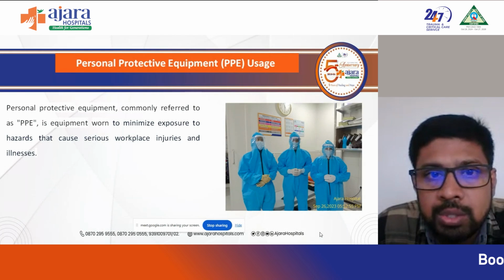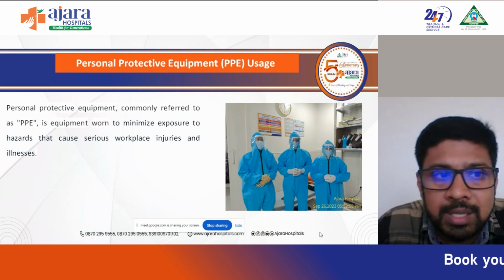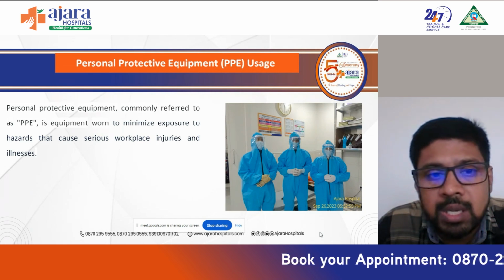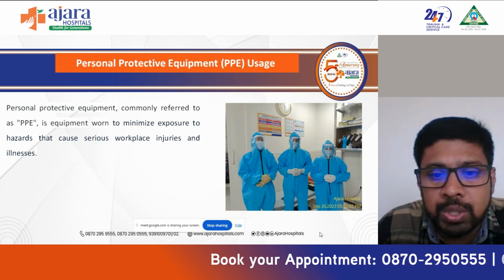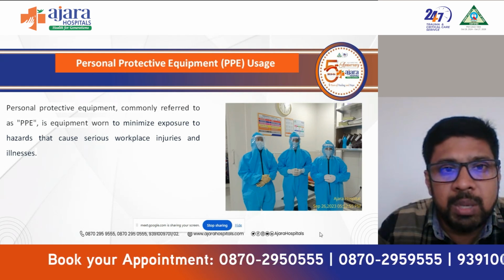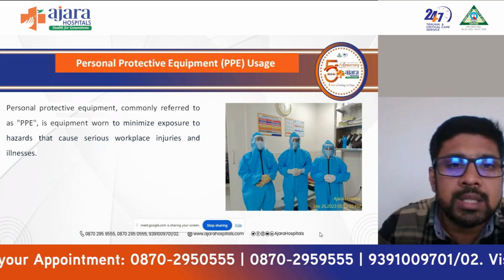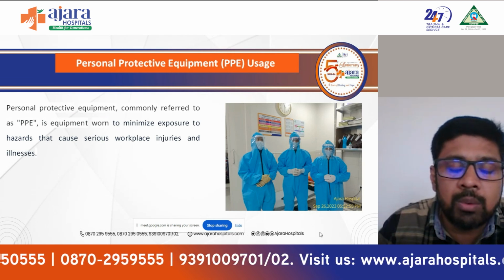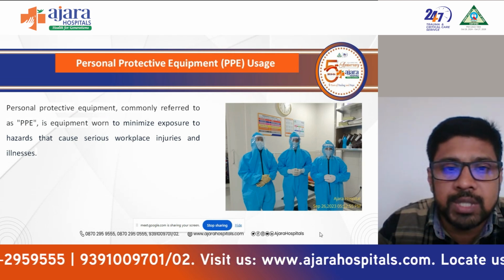Then what is the importance of using PPE in the CSSD department? It is very important to minimize the exposure of healthcare professionals to hazards and avoid serious injuries and illness. So all staff need to wear PPE while they are working in the CSSD and handling the soiled instruments in the washing and disinfection process.